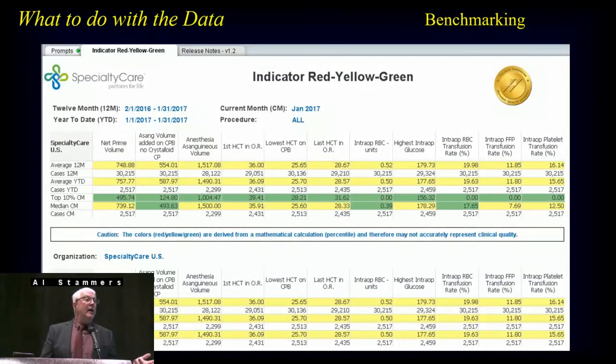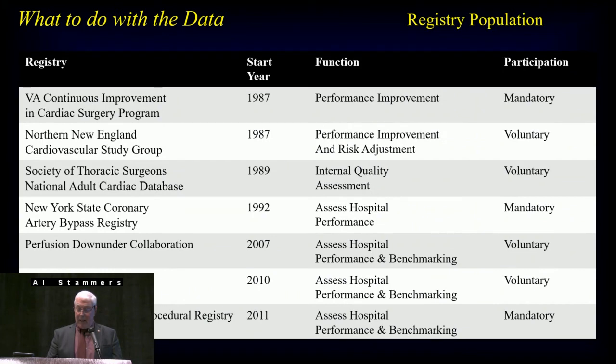You could look by quartile analysis. This is just how to use the data. This is not rocket science. This is just saying, all right, let's separate the hospitals by 25% performance. And you can't read this, but there are a number of parameters up here that were determined to be interesting to hospitals. Some of the other information that is out there in regards to registry.